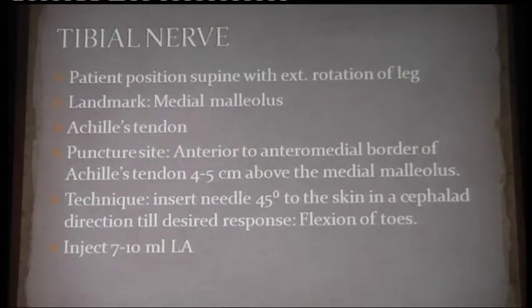Previously, with the blind technique, we used to inject by the side, both sides of the posterior tibial artery. But a calcaneal branch may get skipped when you go distally. So with the PNS, you go significantly proximally, and you will get a better block.